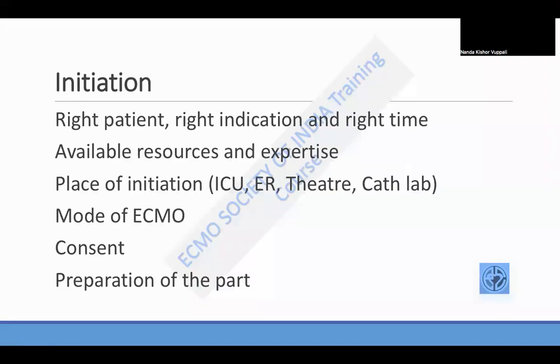Let's start with initiation. The initiation process starts right from when you get the call for ECMO. A lot of the success of ECMO depends on choosing the right patient for the right indication and initiating it at the right time.